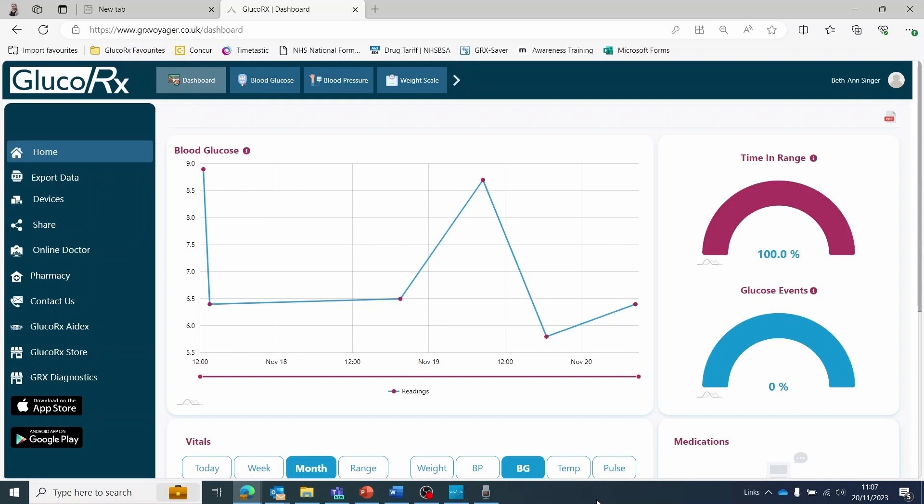If you have connected any of the GRx diagnostic devices, their recent data will also be shown on this page.